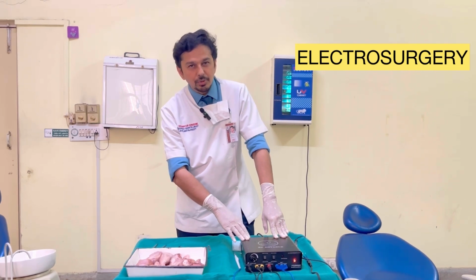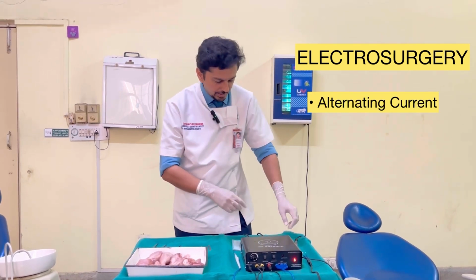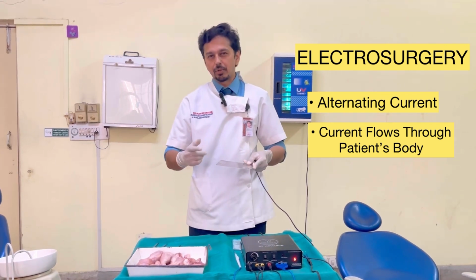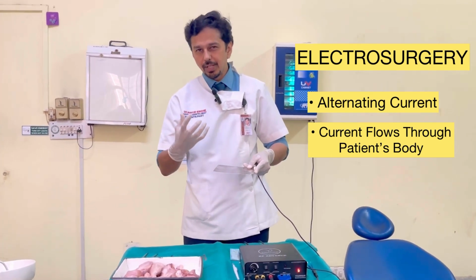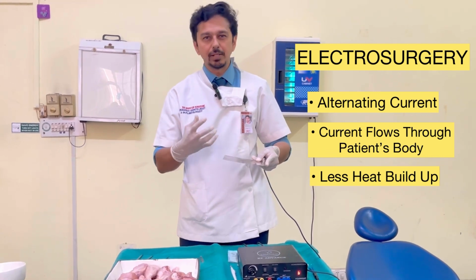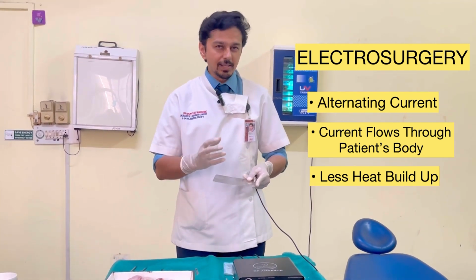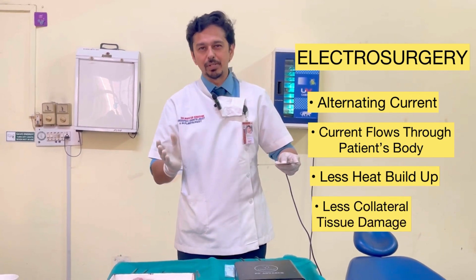Electrosurgery, on the other hand, uses alternating current. Here, because of a conduction plate, the patient is part of the circuit. So the amount of heat required for achieving the desired effect, let's say cutting of tissues, is much lesser. Hence, the collateral tissue damage is lesser.